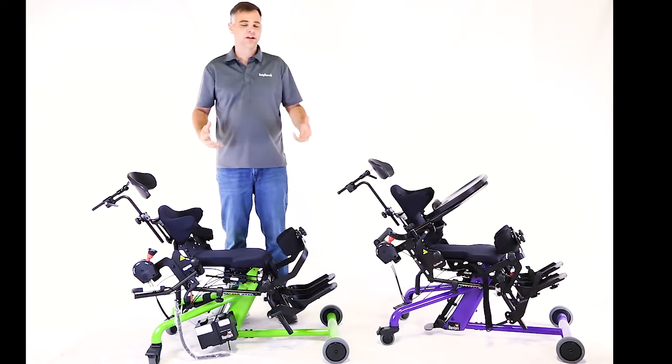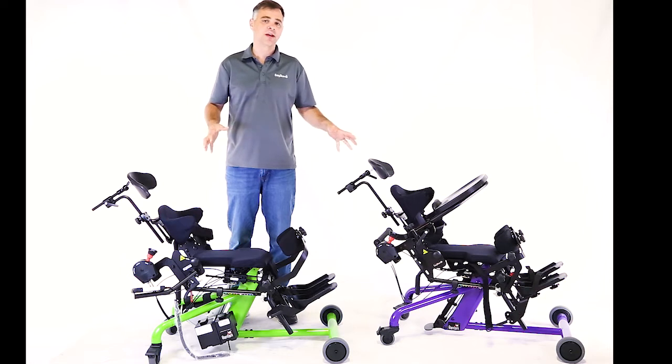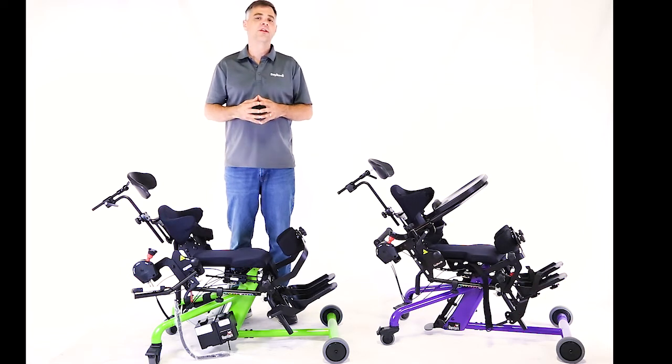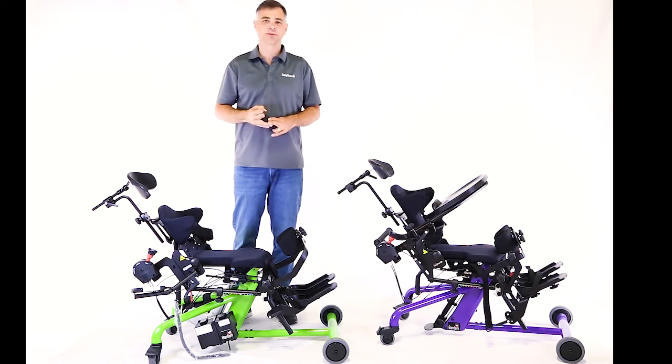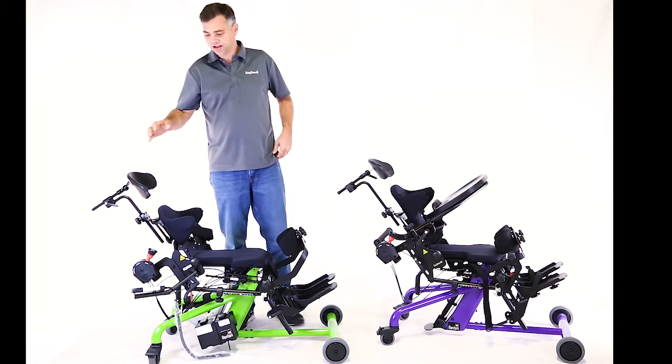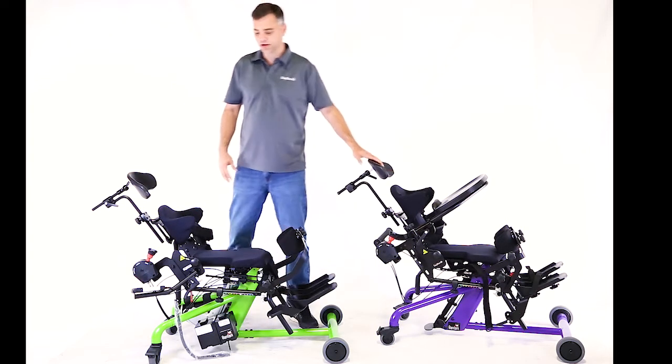Today we're going to talk about the fail-safe option on the Easy Stand Bantam Small and Extra Small. This is only going to affect you if you have a Bantam with a power-up option or a hydraulic option. What I have here today is one Bantam with a power-up option and one Bantam with a standard gas spring, just to show you the difference.